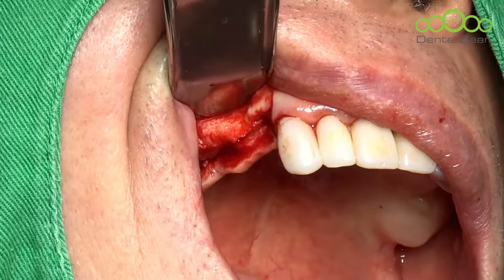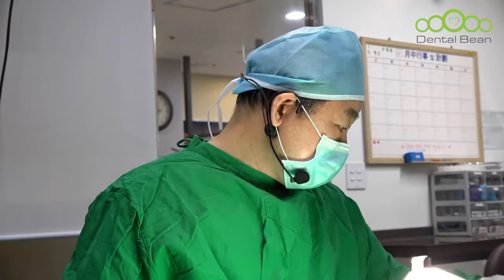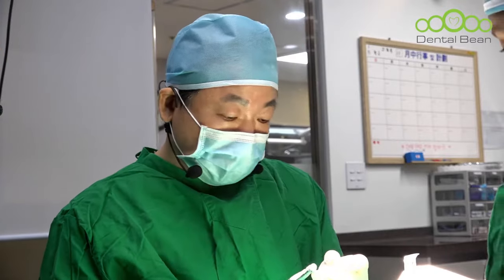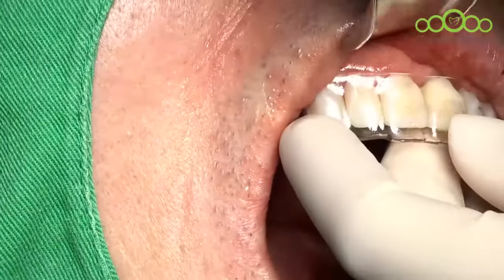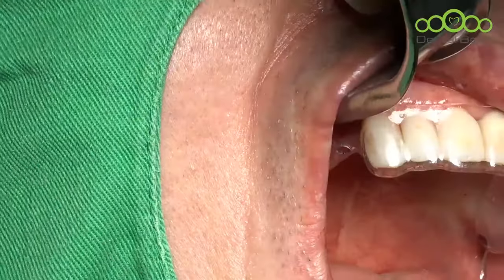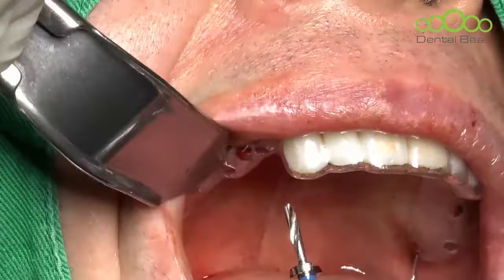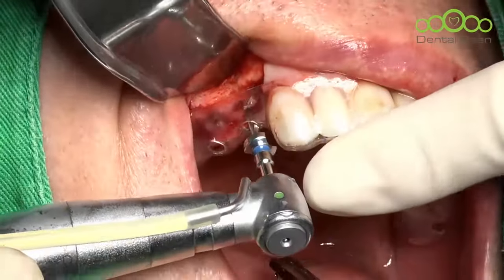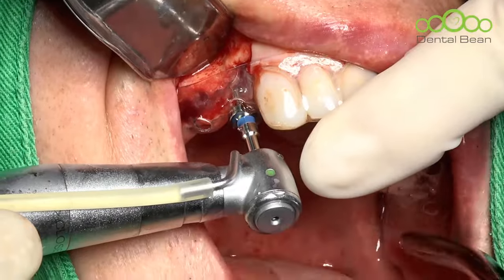Okay, let's try the surgical guide. Guide drill. Maybe 1.8. I will place a 10 millimeter implant. So, insert here. I will prep the hole with a 1.8 twist drill. It is reverse.